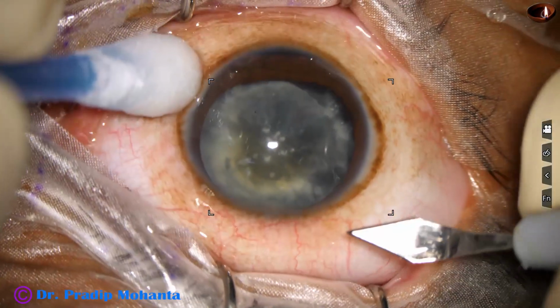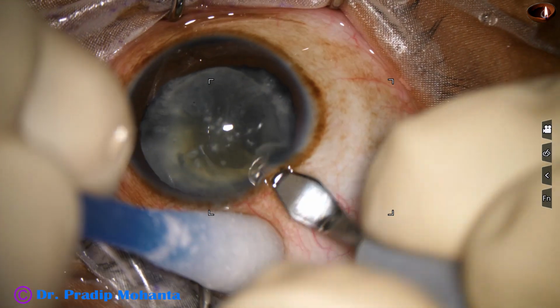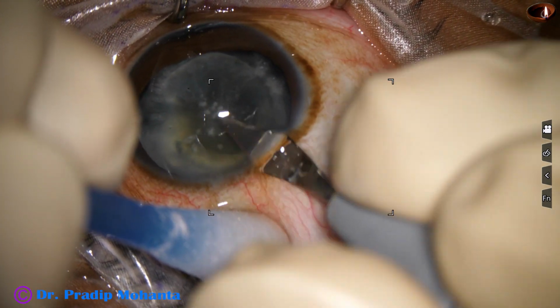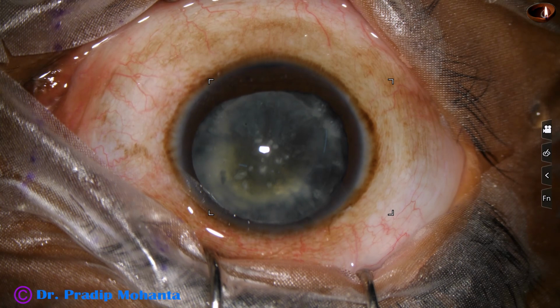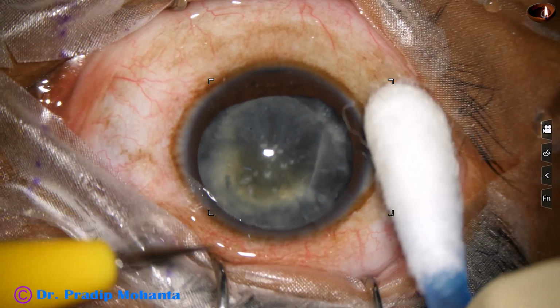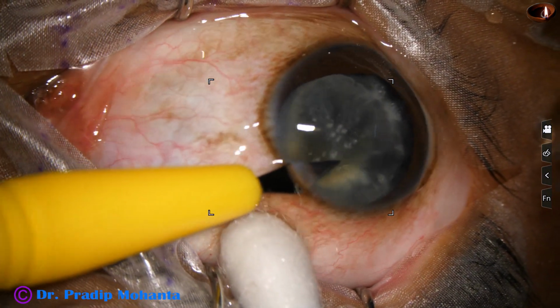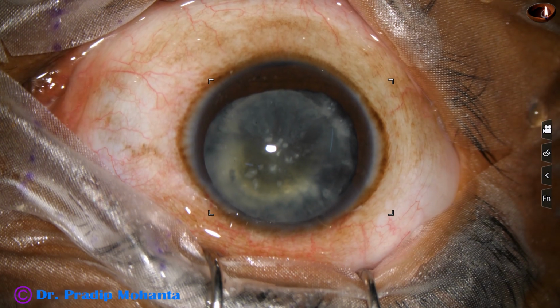This is a cataract with iridodialysis at 6 o'clock. There is a history of trauma. The patient is young, about 30 years old. Let us observe management of this case.